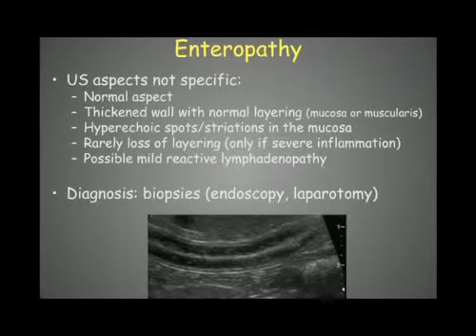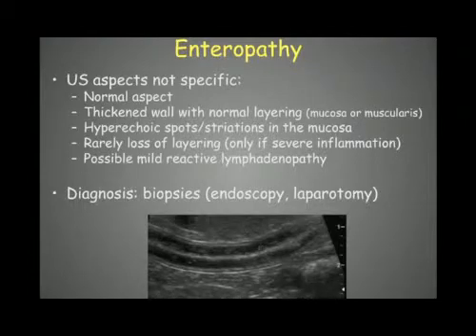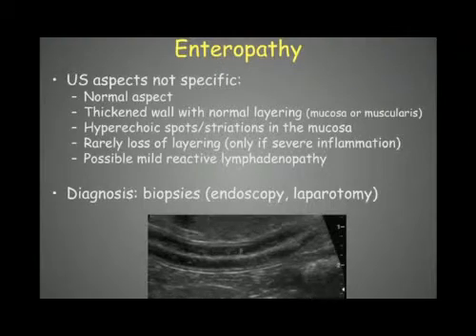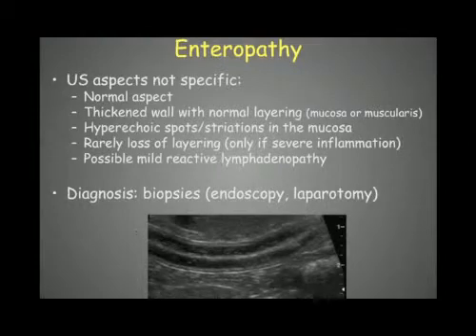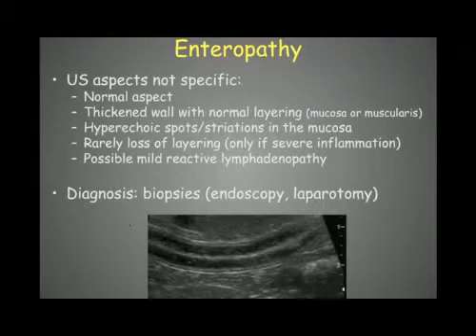If we see hyperechoic spots or striations in the mucosa, it is a better sign of inflammatory bowel disease, as seen here with these hyperechoic spots and striations. This is generally associated with lymphangiectasia, and at least helps confirm that something is wrong in the intestinal tract.